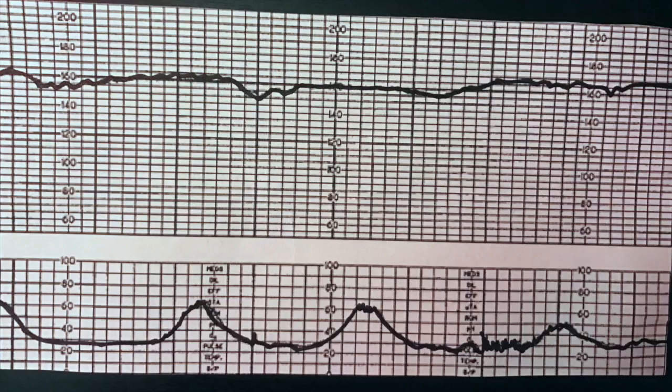This is the electronic fetal heart rate monitor. An external transducer is placed on the maternal abdomen and held in place by an elastic belt and girdle. For example, this is a decrease or loss of the fetal heart rate variability. On the bottom, you're going to see the mother's contraction, and on the top, you'll see the baby's heart rate dip a bit.